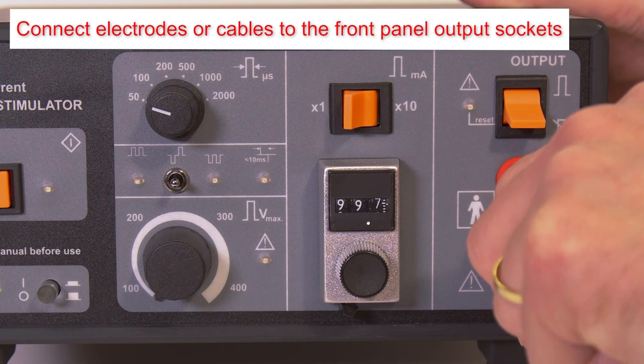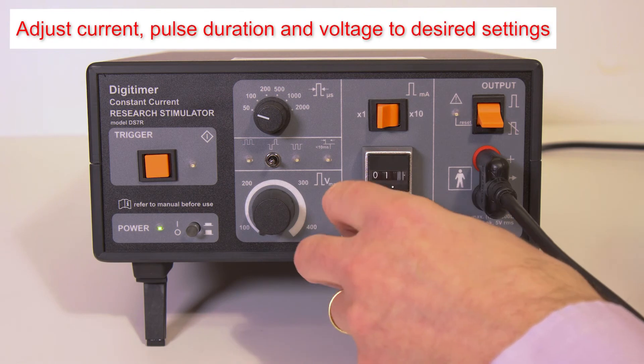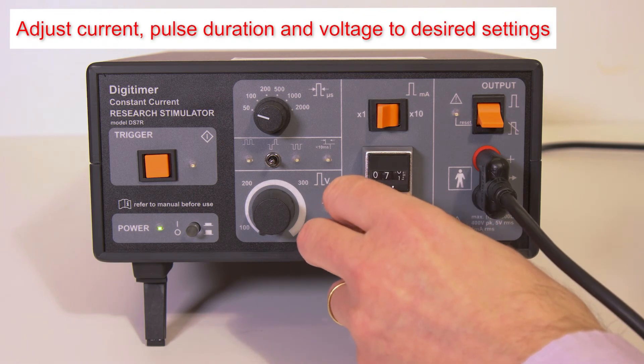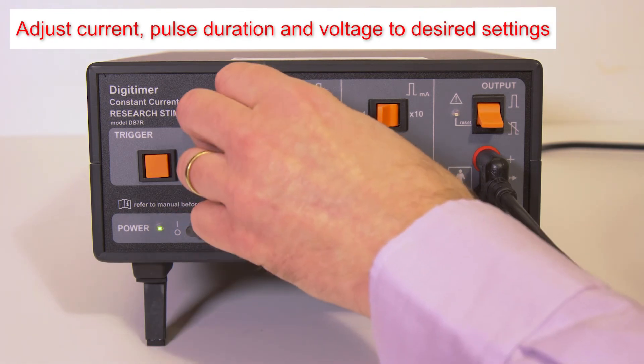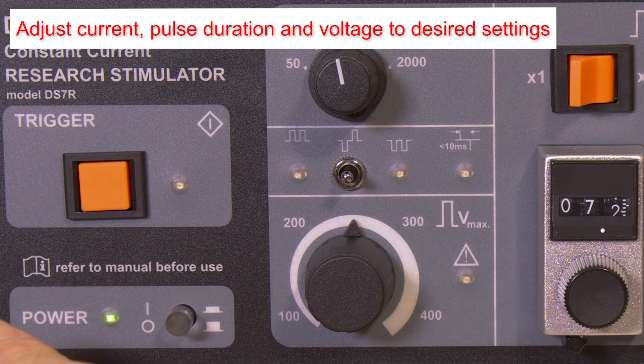Check the current output cable to the 4mm touch proof sockets on the front panel. Once electrodes are connected to the subject, the current, pulse duration, and voltage should be re-adjusted to the required levels.